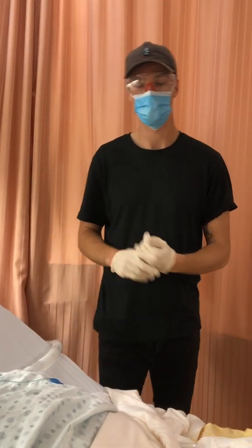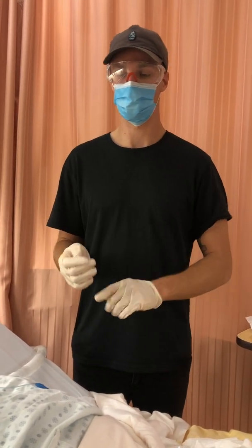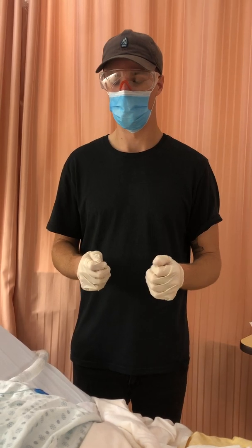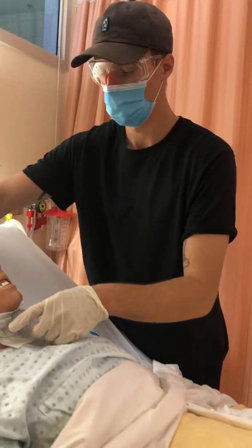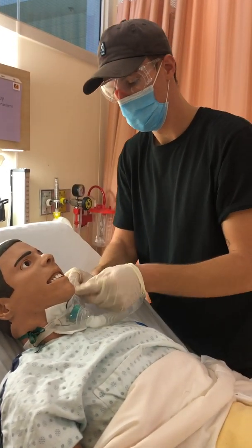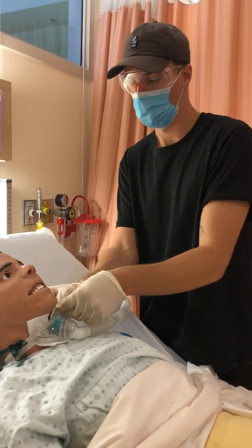One thing, I did assess the stoma beforehand, but I would have done a better job of assessing it after I cleaned the stoma. I forgot to do that. Other than that, I put this back on here. Give my patient some oxygen, tell them to take 2 to 3 breaths for about 30 seconds. Okay. Make sure that the oxygen is on 10 liters as ordered by the physician.